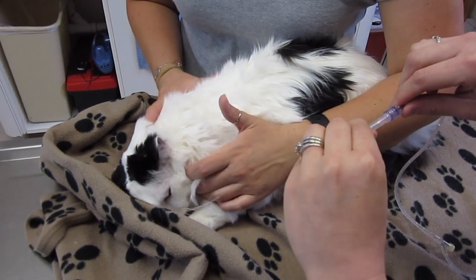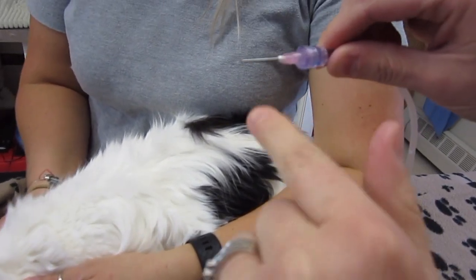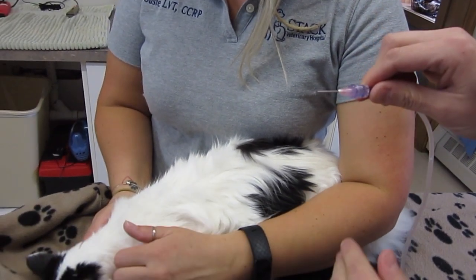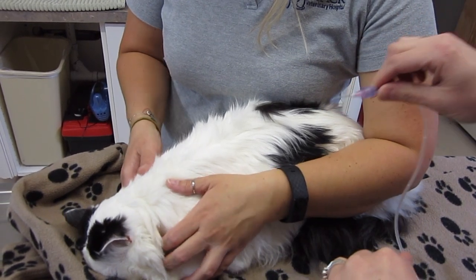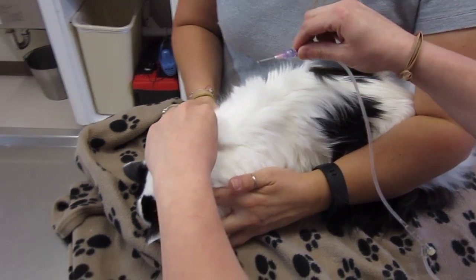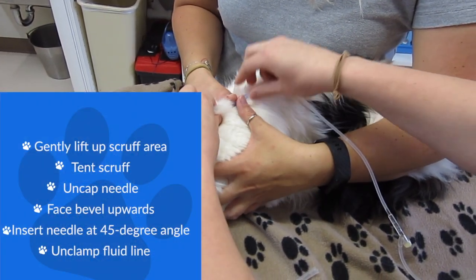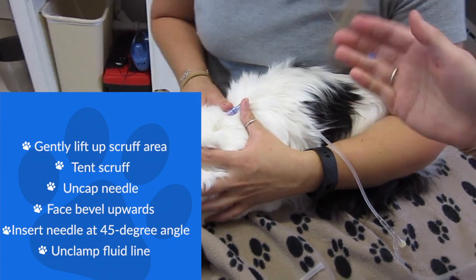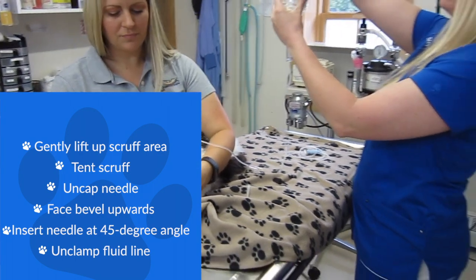And what I'm going to do is uncap the needle. And you can see, it's probably hard to see in the video, but there is a bevel here on the needle, and you want to make sure that part is up. The bevel is basically just a small indentation, just to allow for easy flow into the skin. So we're going to tent up our skin, and we're going to go directly in, and you feel a pop sensation, and then your assistant or someone else that's helping you will hold that in place. And what I'll do is hold my fluid bag up.